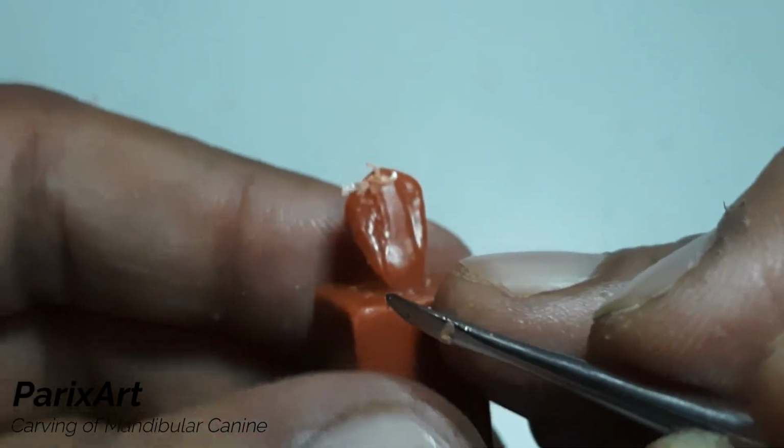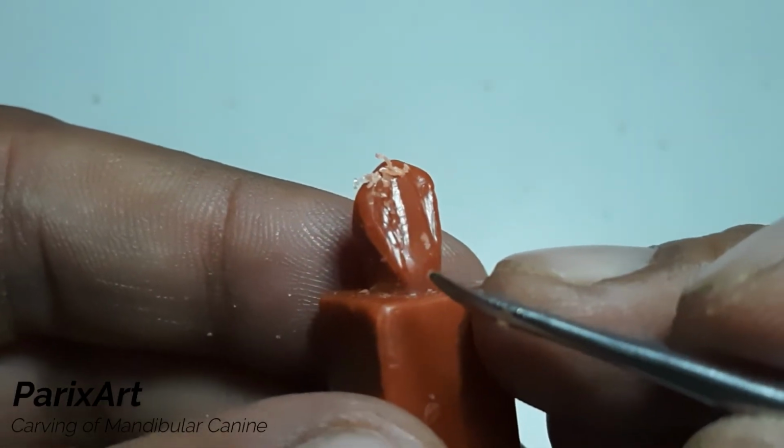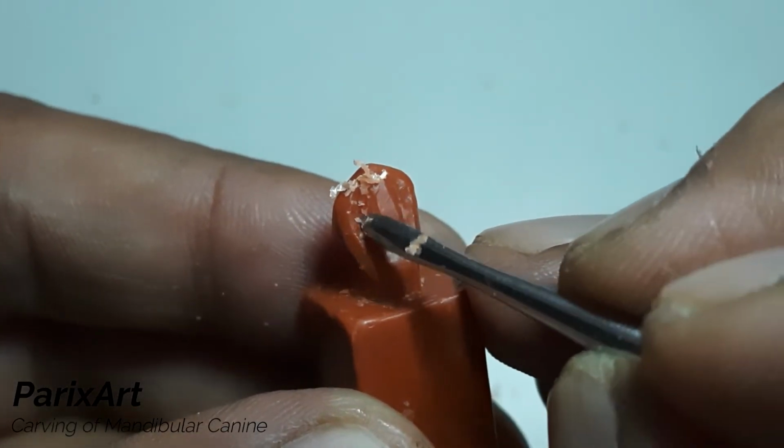If you notice, we are following the mesial, distal and incisal boundaries to make the depression.